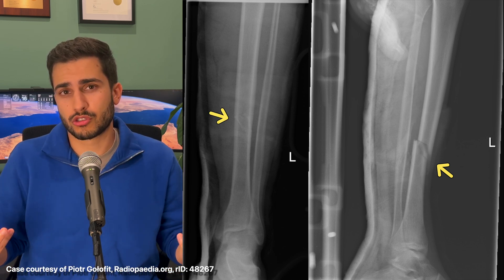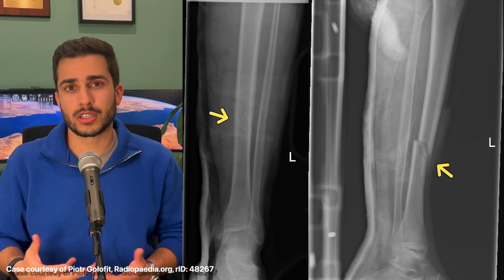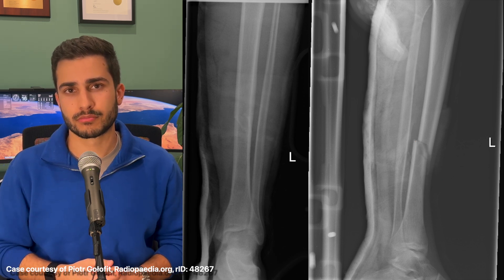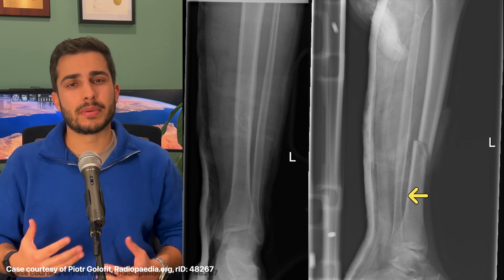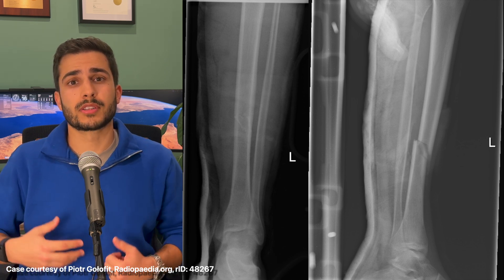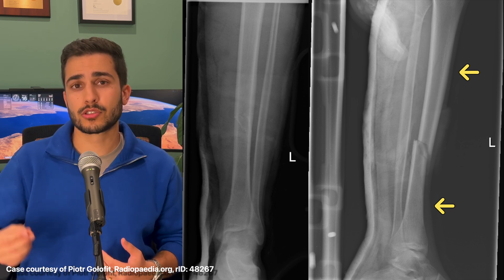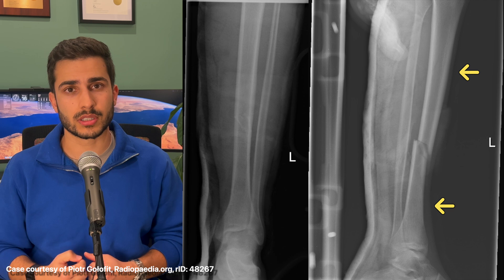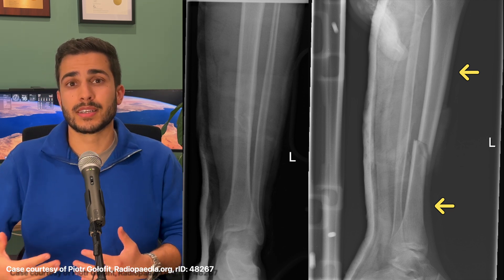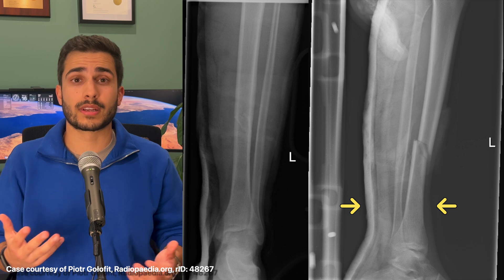This patient presented with trauma and you can clearly see the oblique fracture, characterised by an oblique or slanted line through the shaft of the long bone. In this case, there is actually some posterior displacement — meaning it's moved backwards. Anytime we describe a displacement, it's always describing the position of the distal fragment with respect to the proximal fragment. So here the distal part, aka the part that connects to the ankle joint, has been mildly displaced posteriorly with respect to the upper proximal part of the lower leg.